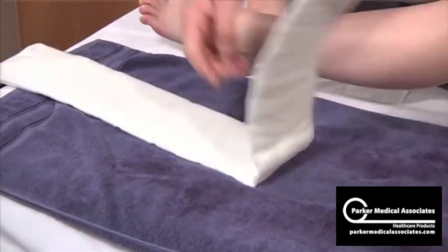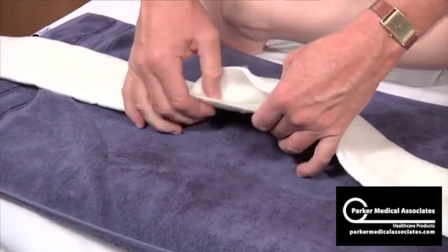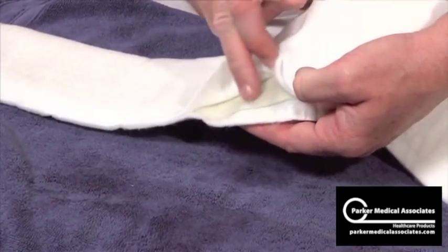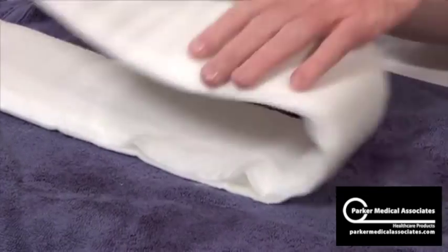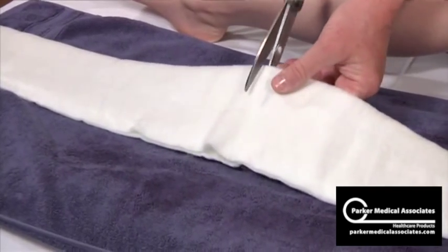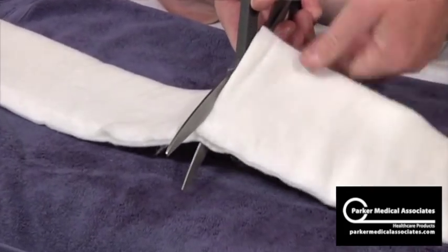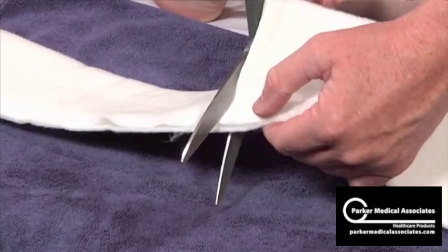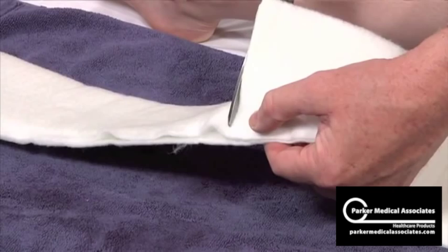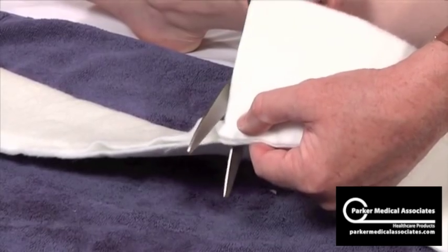Now cutting from closed to open. Remember, this is the open side — the double-faced tape. You can see where the fiberglass ends right there. You want to cut all the way through this fiberglass, cutting from closed to open, finding the middle, all the way through. Now use the whole scissor. When you get to about a half an inch away, just take the tips back — you feel the fiberglass is right there. Just take the tips and put it right where the fiberglass ends and snip. Otherwise you may go all the way through, so just use the tips.